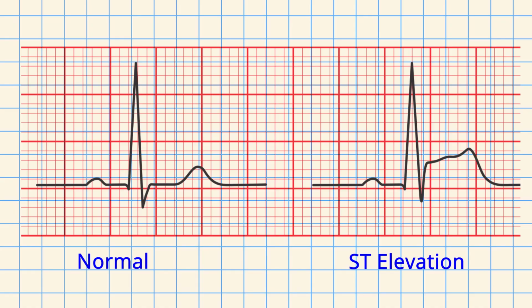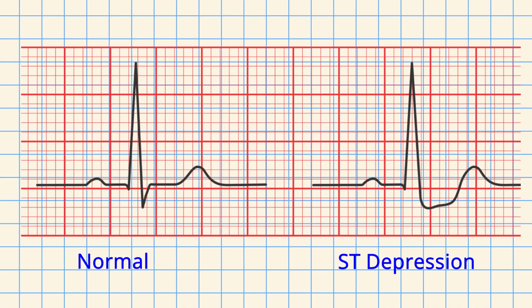NSTEMIs, on the other hand, do not go through the full thickness of the heart. STEMIs cause ST elevations. NSTEMIs do not cause ST elevations, but you rather see ST depressions and T-wave inversion. A whole lot of little differences that if one were to speak with a cardiologist, he or she could shed some great light upon. For the purposes of this video, I think we will stick to just this basic.